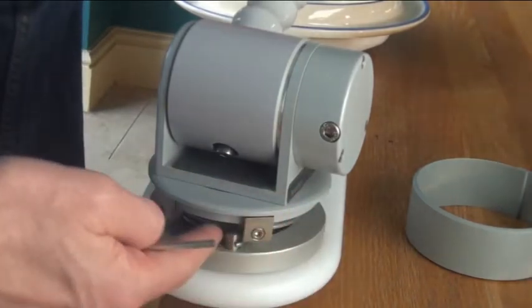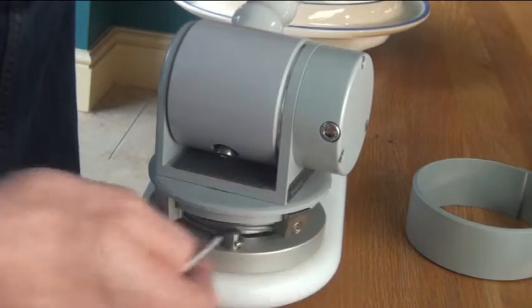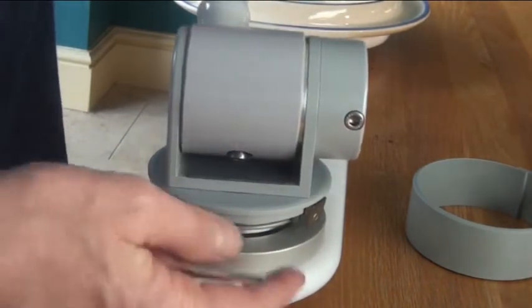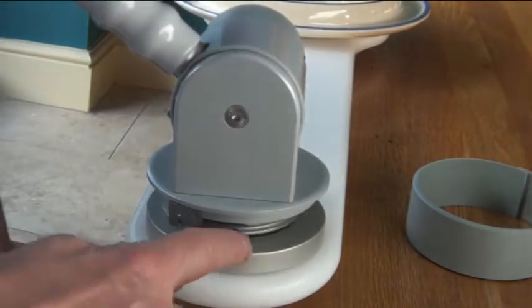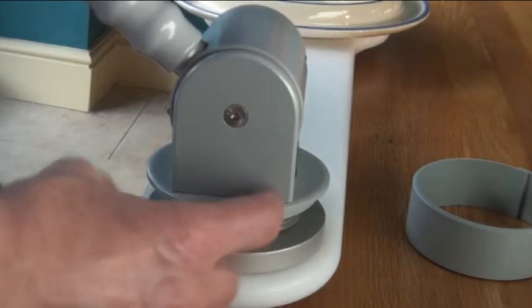If you want to adjust the spring tension, you first of all need to release these stops and allow the arm to move all the way forward so that the tension is removed completely from the spring. That's quite important so it doesn't twang around.